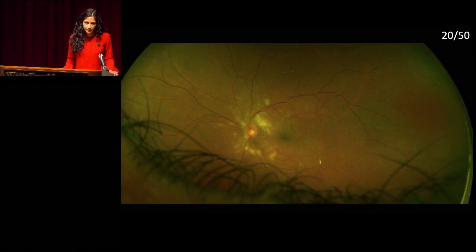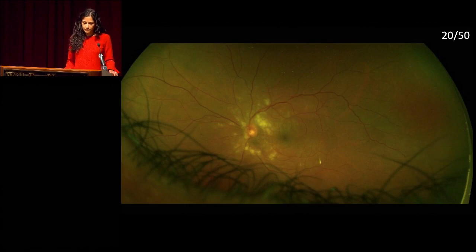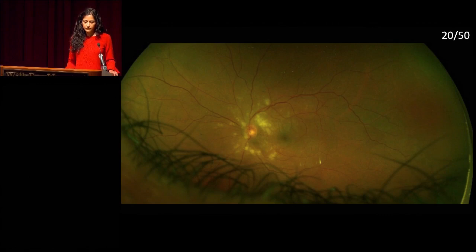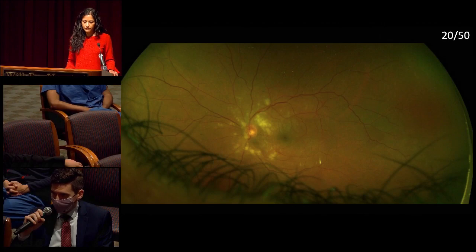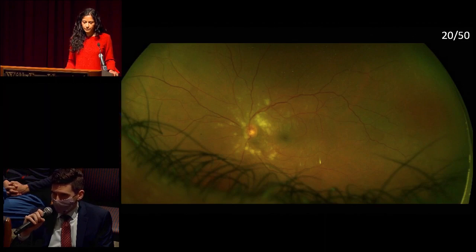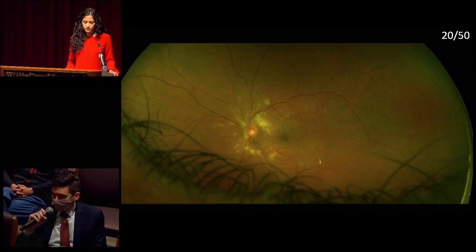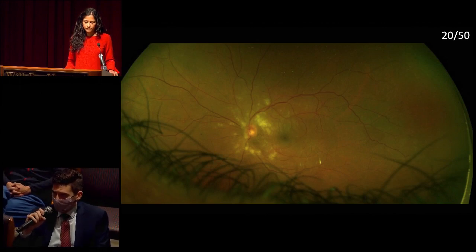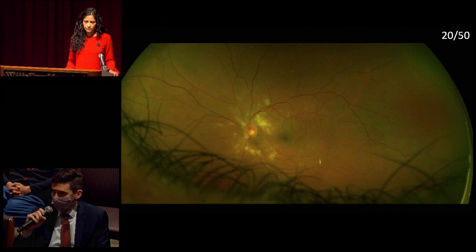In the left eye, vision is 20-50. The media appears clear. The disc has relatively sharp margins, but the eye is drawn to extensive peripapillary areas that appear to be cotton wool spots or retinal nerve fiber layer infarcts, with possibly some deeper retinal whitening in the macula. No prominent retinal hemorrhages. The vessels show a little more tortuosity than the contralateral eye. The periphery looks relatively normal with no hemorrhages or lesions, and the fovea appears uninvolved on color imaging.